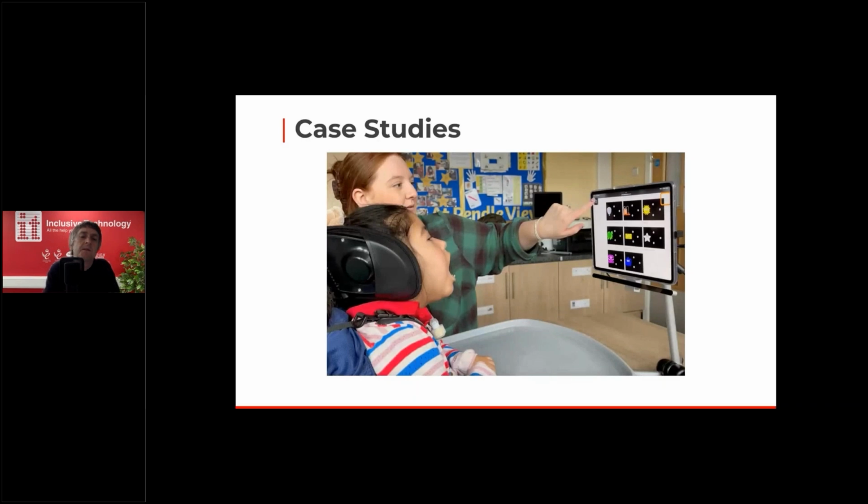Now, just to give you a bit of a better idea of these things working, I thought it would be a good idea not only to show myself giving a demonstration of the apps and the product, but also I went into one of our schools recently, Pendleview Primary School, and was able to get 3 other pupils using Eyetuitive.